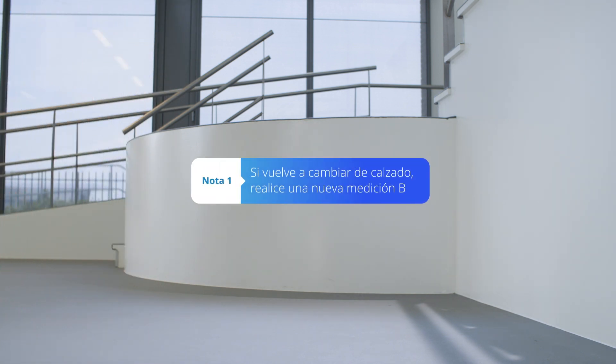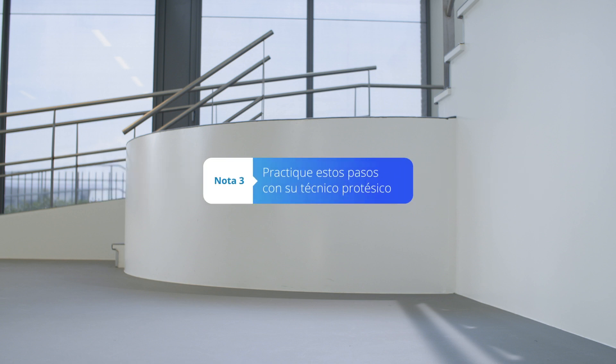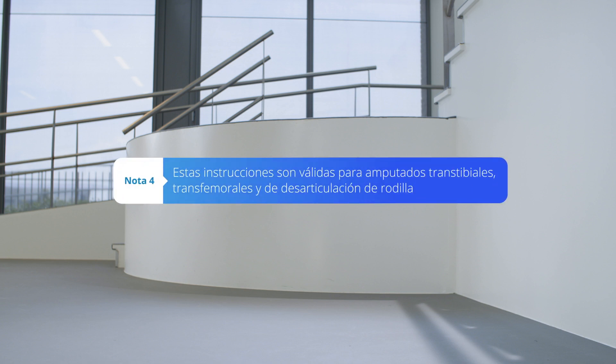If you change your shoes again, measure a new measurement B. If your socket or prosthetic alignment has been changed by your prosthetist, measure a new measurement A. Please practice these steps with your prosthetist. These instructions are applicable for transtibial, transfemoral, and knee disarticulation amputees.